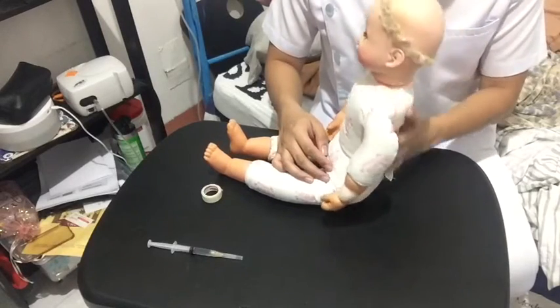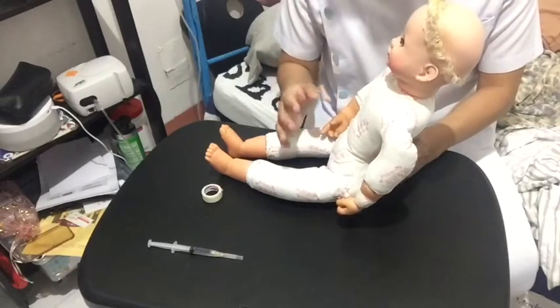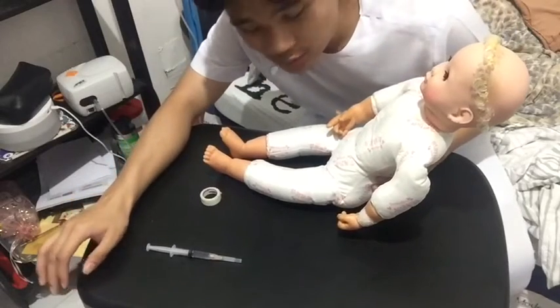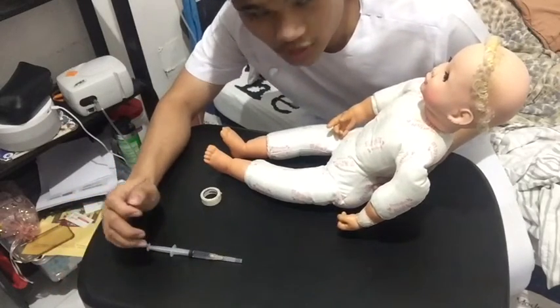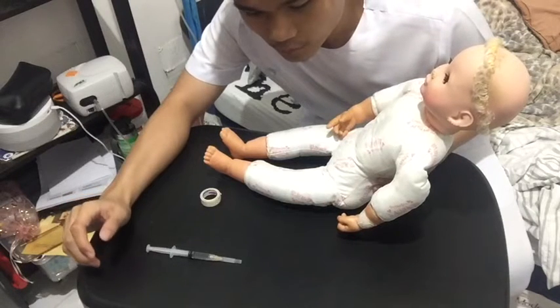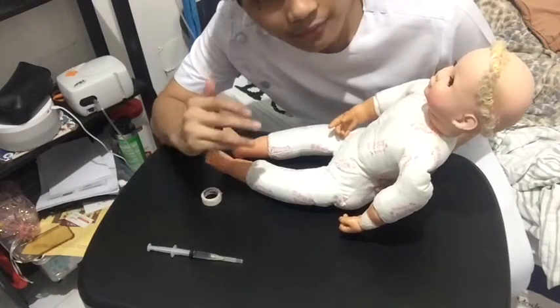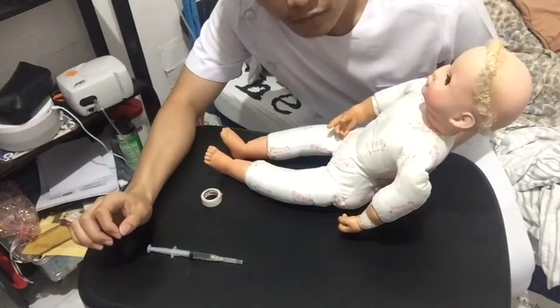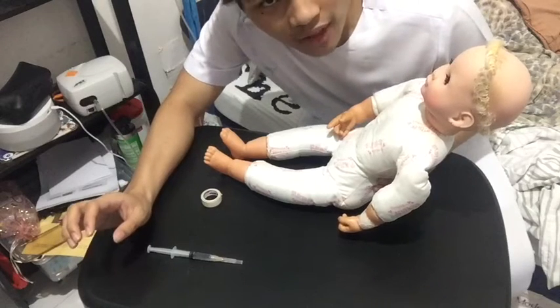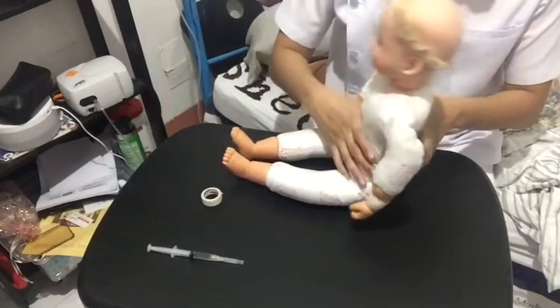Now, after placing the client in a proper position, which is the upright sitting position, if this isn't a baby, what we usually do is explain to the client how to breathe properly. Proper breathing technique consists of, while holding the nebulizer, inhaling deeply through your mouth, holding it in for a couple of seconds, and then exhaling through your mouth. Then take short breaths before having a deep inhalation.